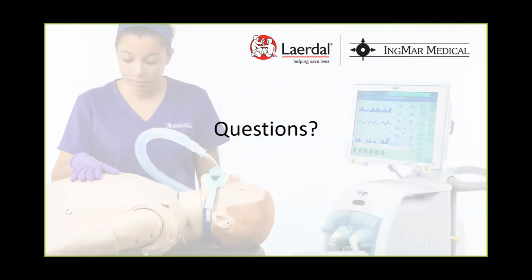So Brian, we have for you, do changes made in the ASL 5000 windows automatically trigger changes to the SimMan's vital signs? Not completely, though as we demonstrated today, it's fairly easy to use a simple theme to integrate the vitals of the SimMan with the control of the ASL 5000. But the respiratory rate, as detected by the ASL, is automatically linked to the respiratory rate on the Laerdal patient monitor.